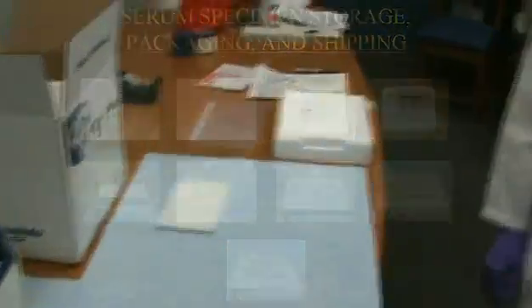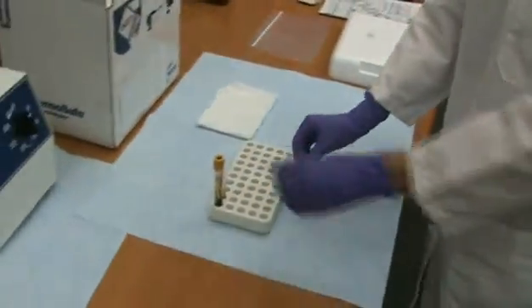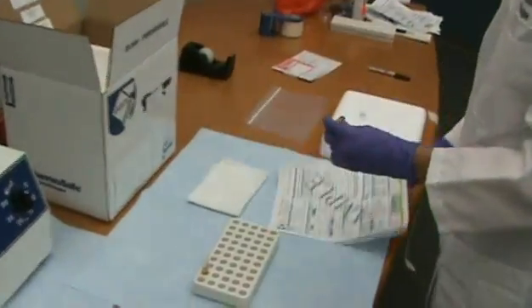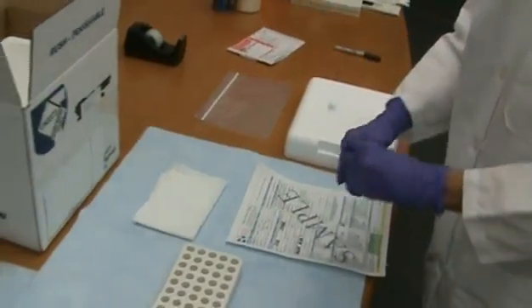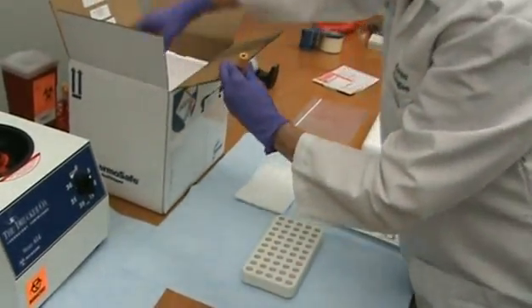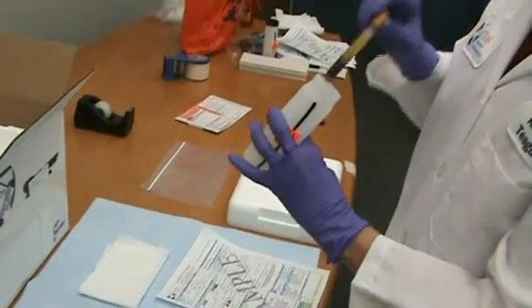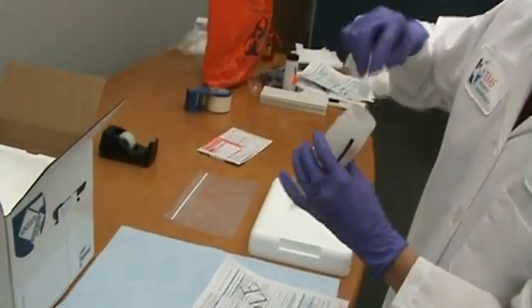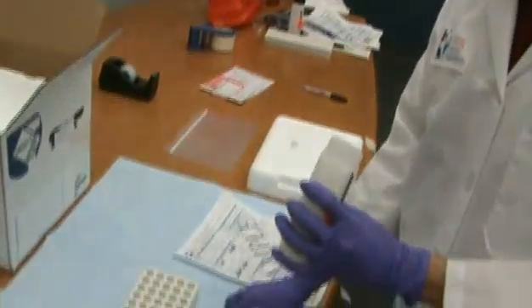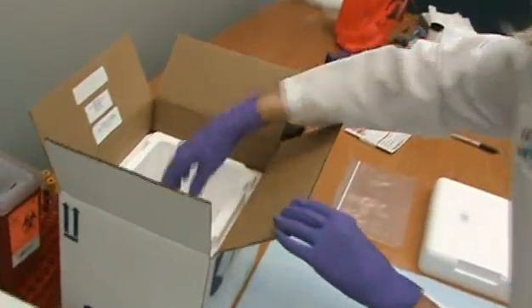When the specimens are ready to be shipped, remove the tubes from the cold storage. Check that the name on the tube matches the name on the specimen submission form. Place the specimen tubes in the plastic container provided with the shipping box. Remember to add absorbent material sufficient to soak up any liquid in the tubes.